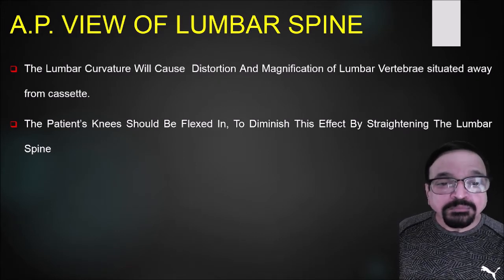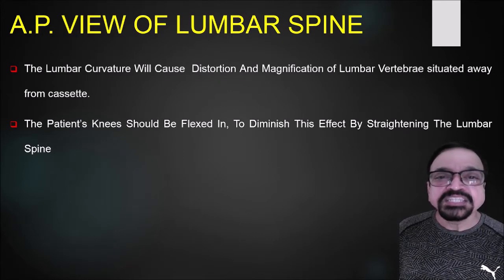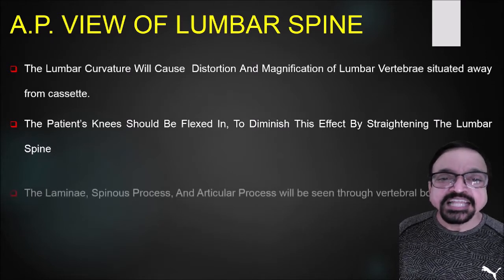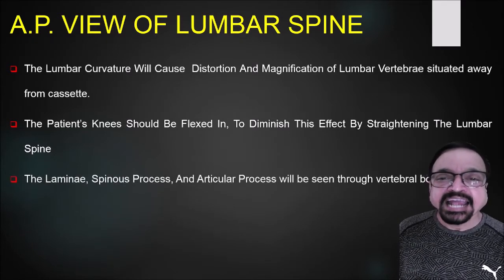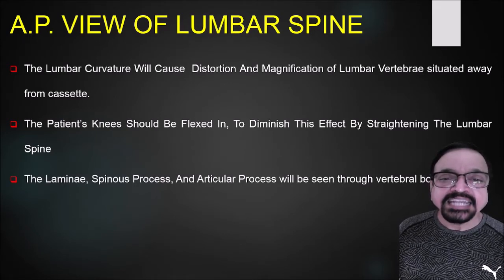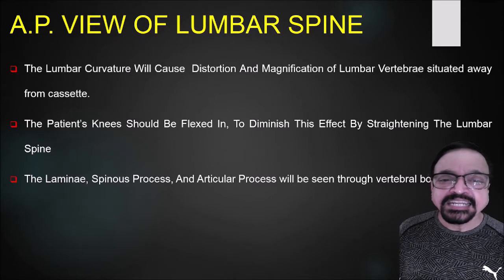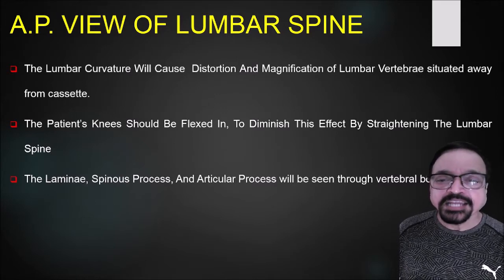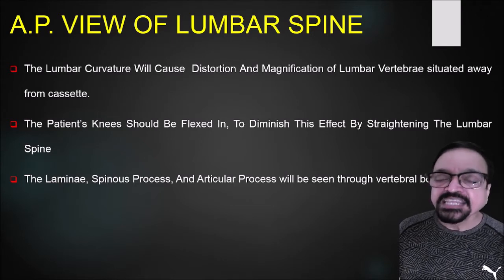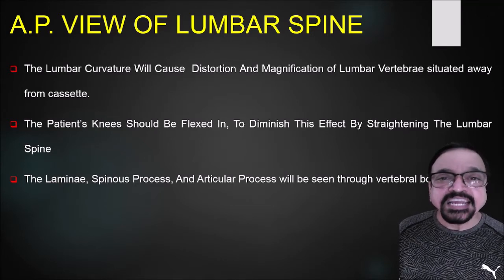Now this is important because a radiologist has to see all the borders of all vertebral bodies. Otherwise a serious mistake can be made, and this can easily be eliminated by proper positioning of the patient. You flex the legs so that the entire spine touches the table. Then the lamina, spinous process and articular process will be seen through the vertebral bodies. So this is important as far as exposure factor is concerned.